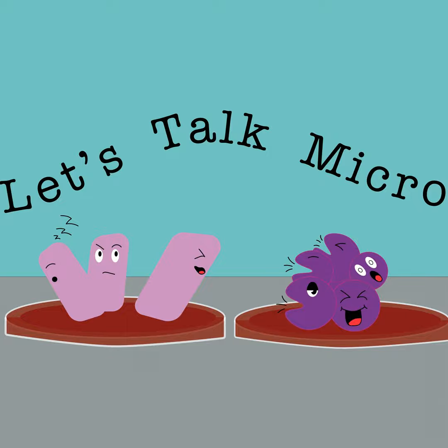Nowadays, in the molecular age, it's so much easier. You can get an ID so quick. So it's good practice. Also, you have to keep in mind with the Optochin disc, a lot of times techs take them out at the beginning of their shift, and then they forget, so they leave them out. A lot of times they don't work properly, and I've seen this a lot.